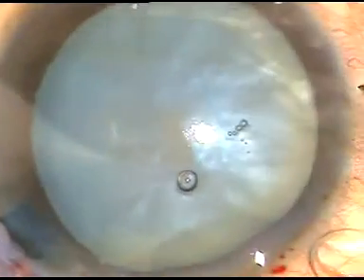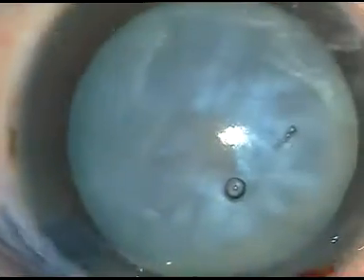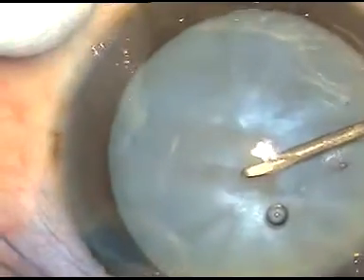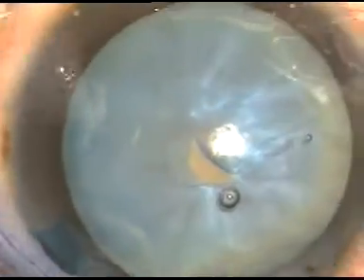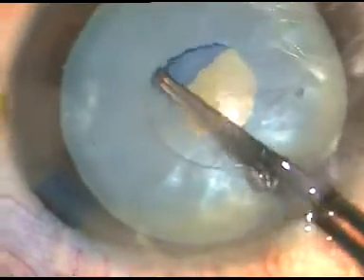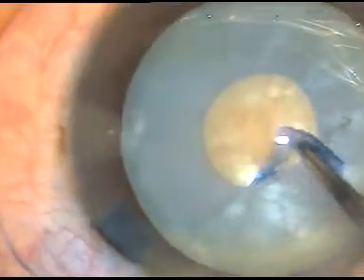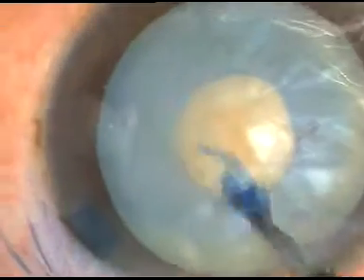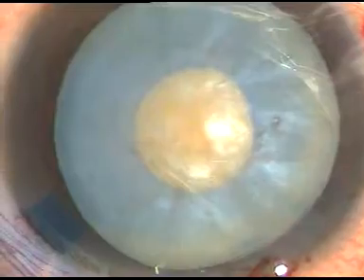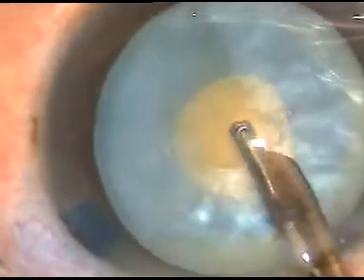If you have cohesive viscoelastic substance, it is fine, but it is not necessary. Now I incise the capsule, and in this case a little bit of oily fluid comes out. It means the intralenticular pressure is raised, but not as much as the previous case. Now this is a mini rhexis, and through this small opening I introduce a Simcoe cannula and aspirate some cortical lens matter.